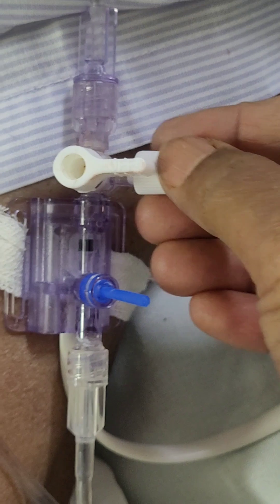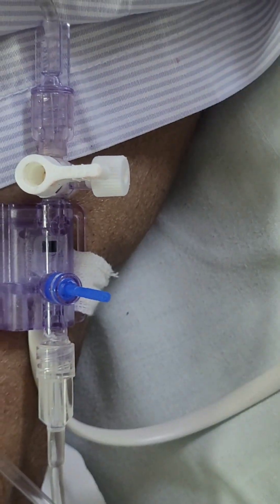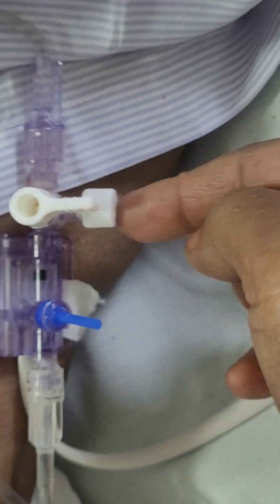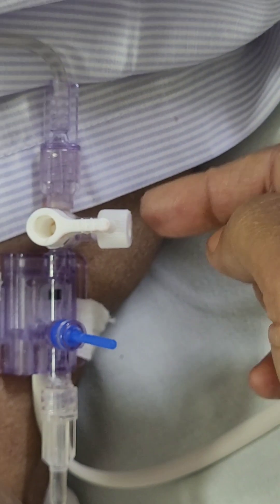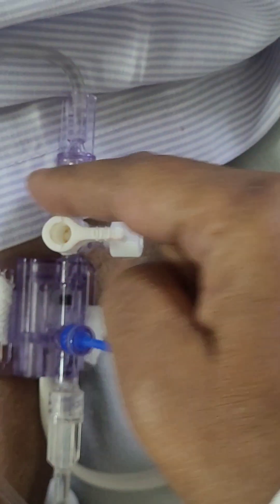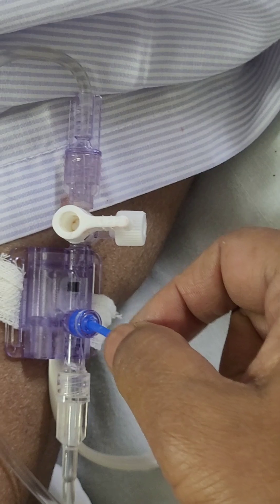There is another port — this opening is for the atmospheric opening. As you can see, this port faces toward the atmosphere, and it is closed right now. Whichever direction we keep it, that direction will be closed.